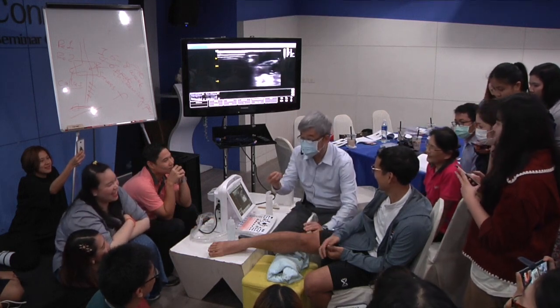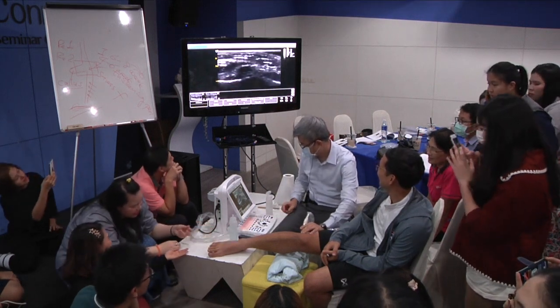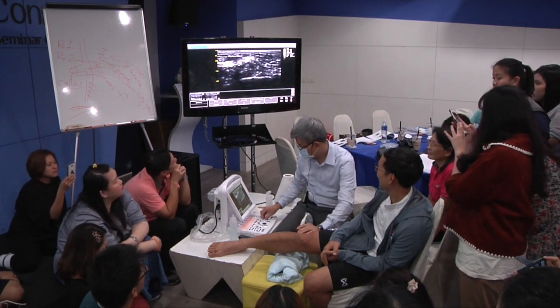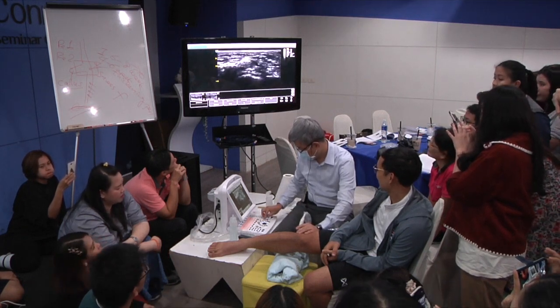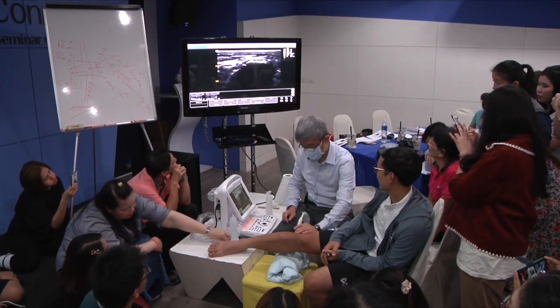Because there is some gel, so it's alright. It's disposable. Right. We got the, okay, fibula head.